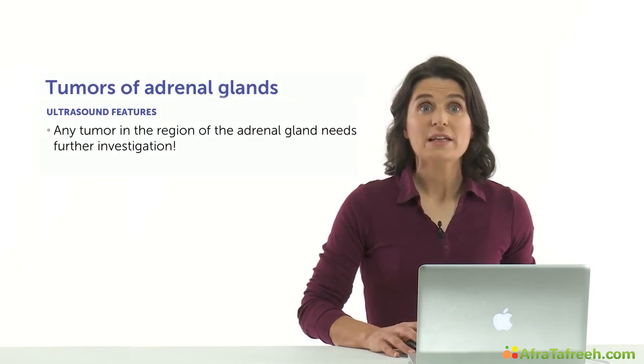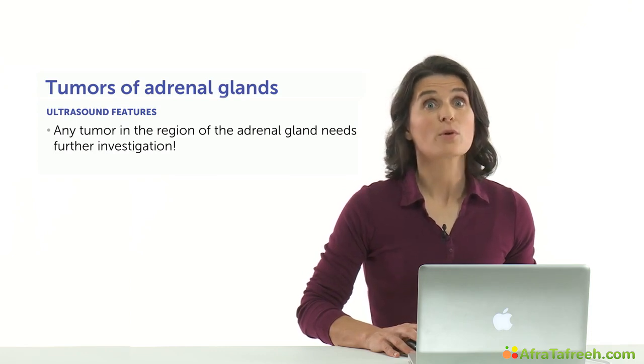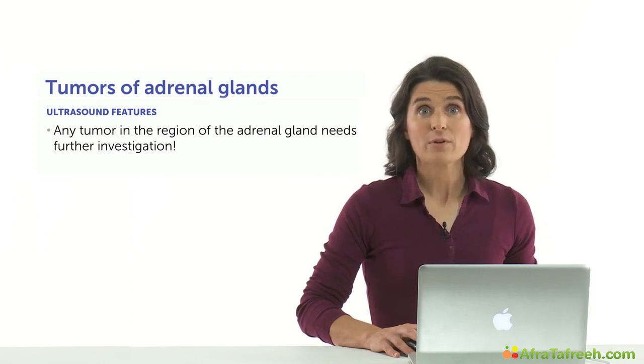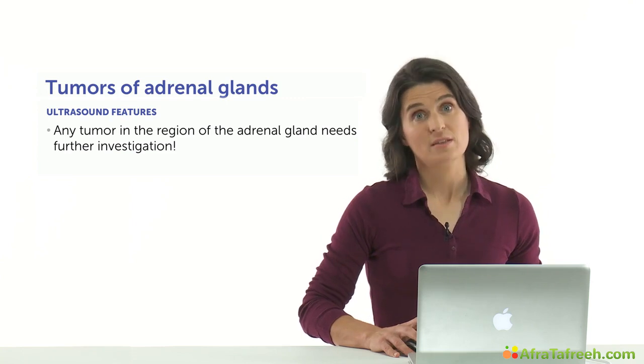For detecting a lesion of the adrenal gland, we need to assess the region of the organs thoroughly in our ultrasound scan. When a tumor in the area of the adrenal gland is found, further investigation is indicated anyway.